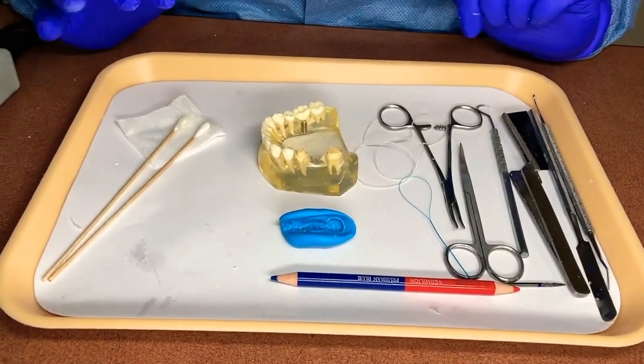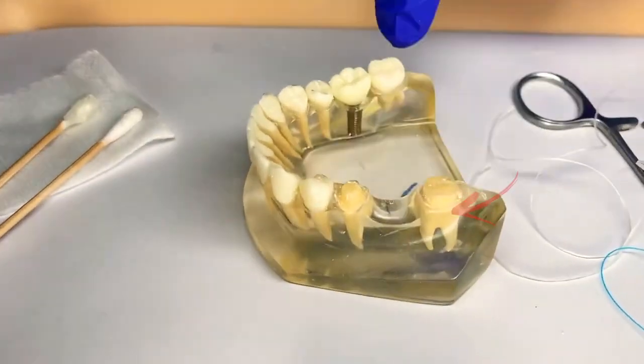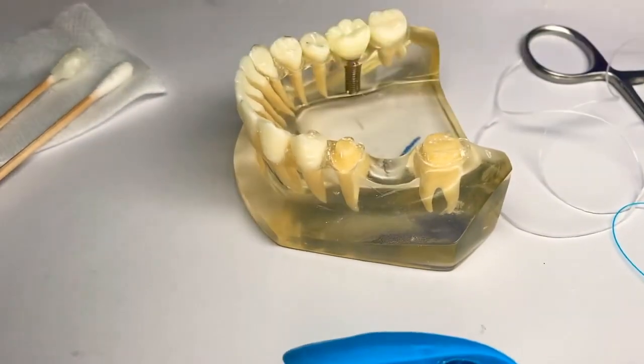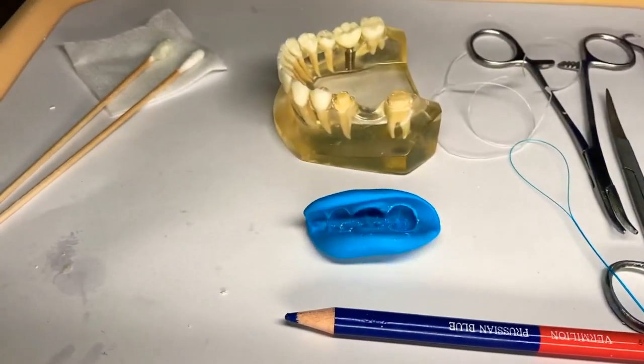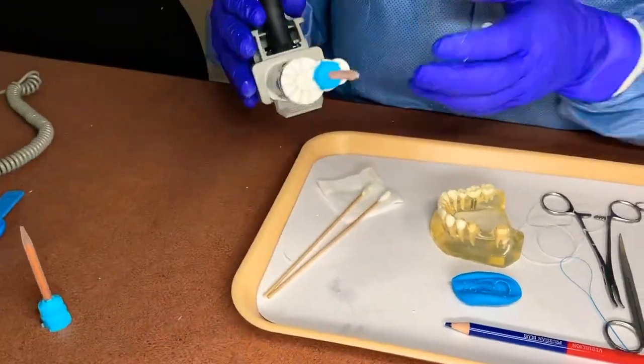We have our prepped bridge from our doctor: our abutment, our pontic where the missing tooth is, and our abutment. We have our bite and now we have our Turbo Temp. We're always going to start with a new tip.